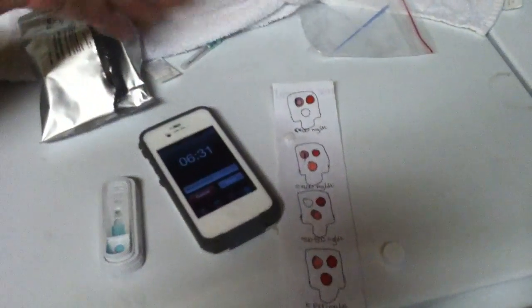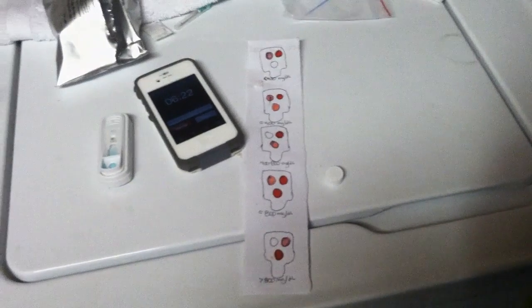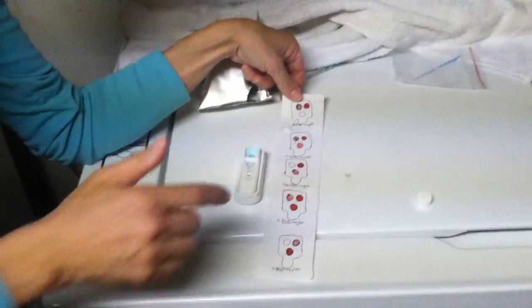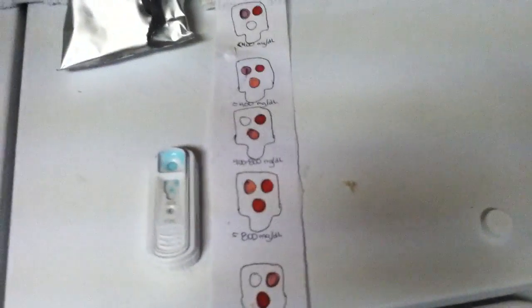At this point they just didn't get any. And if they're under 24 hours old we can do plasma and colostrum and everything, but after that they don't absorb it anymore. So we've had our results now, and this matches best with this one right here. Since this is really bad and this is really good, we're close enough — so that's good, much better.